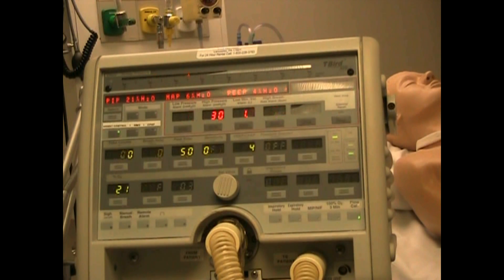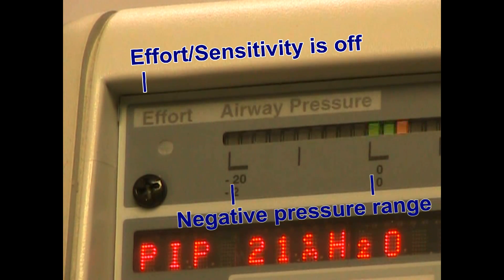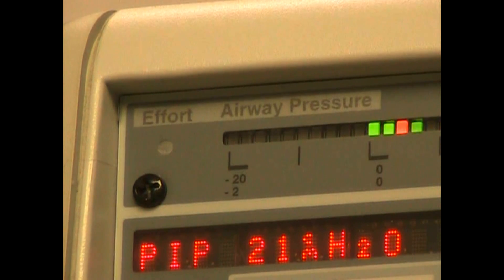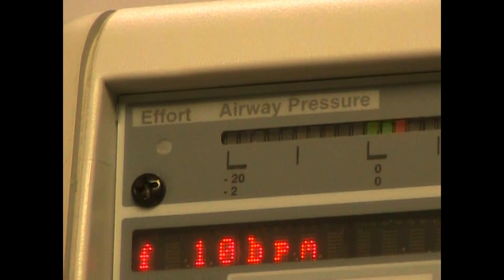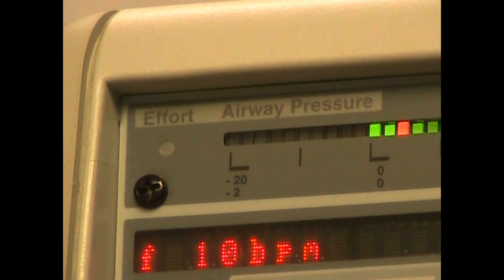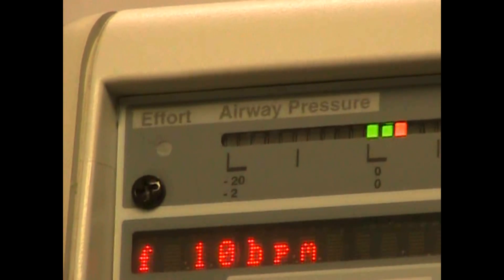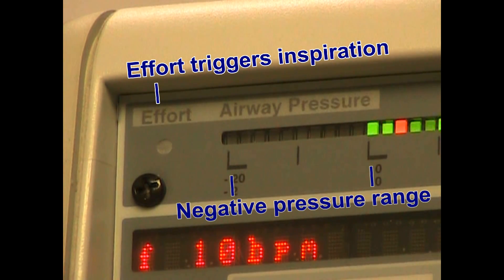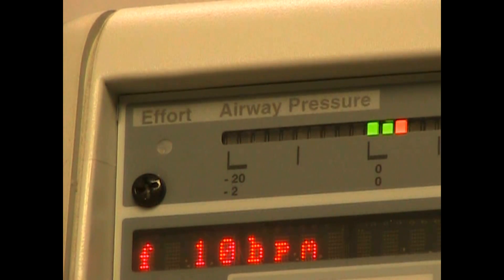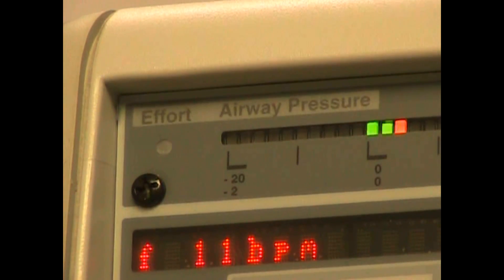Let's go to a closer view here. Up in the top left corner, if the patient inspires you should see a light. But since we have our sensitivity turned off, it is in a control mode. I'm going to turn that sensitivity on to negative two. Now as the patient breathes, you see the sensitivity light will come on with each breath. They call it the effort.